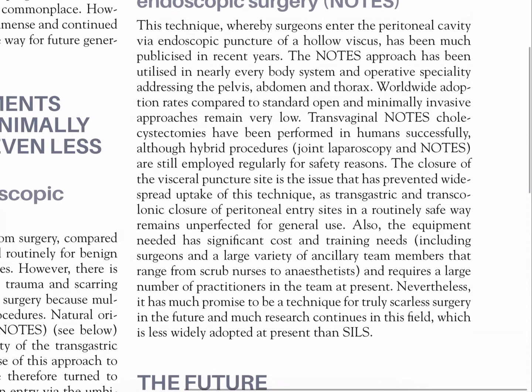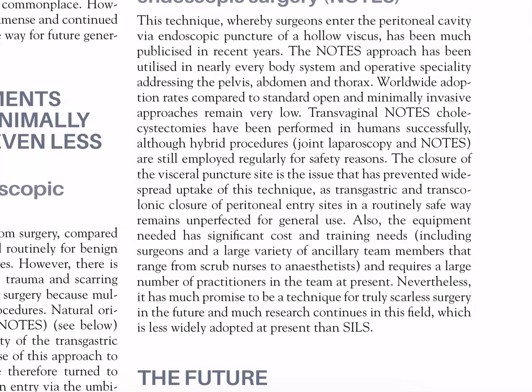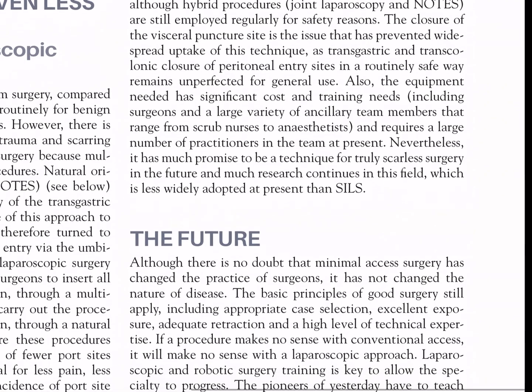Although hybrid procedures, joint laparoscopy and NOTES, are still employed regularly for safety reasons, the closure of the visceral puncture site is the issue that has prevented widespread uptake of this technique, as transgastric and transcolonic closure of peritoneal entry sites in a routinely safe way remains unperfected for general use. Also, the equipment needed has significant cost and training needs, including surgeons and a large variety of ancillary team members that range from scrub nurses to anesthetists and require a large number of practitioners in the team at present. Nevertheless, it has much promise to be a technique for truly scarless surgery in the future, and much research continues in this field, which is less widely adopted at present than SILS.